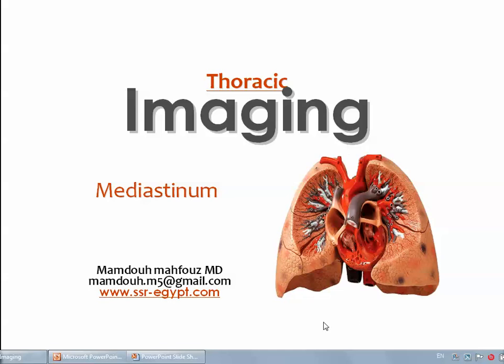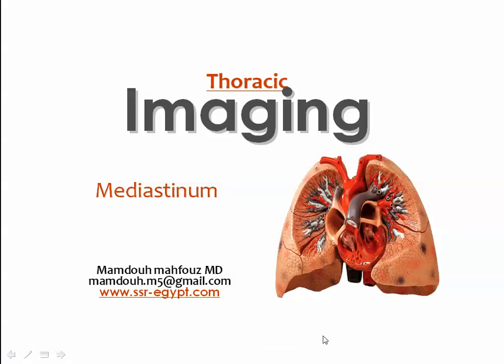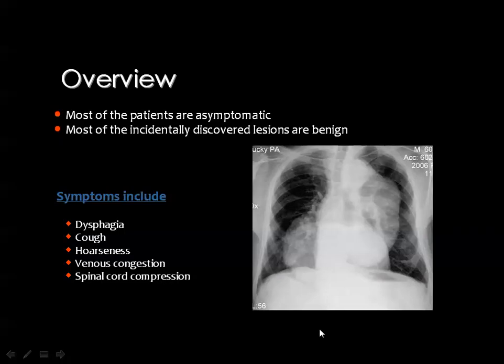These are the major topics in thoracic imaging, and this is the second one, and we will proceed in imaging of the mediastinum, I hope in a simple way, so that you can easily appreciate the mediastinal lesion and you can reach the differential diagnosis.